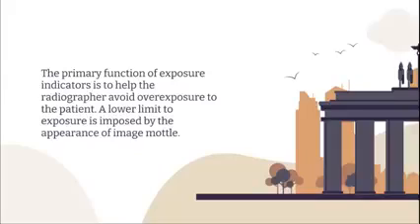Okay? To avoid either extremes, again, overexposure and appearance of image mottle due to lesser provisions of X-rays, it is useful to define a target range for the exposure indicator within which the radiographers should strive to keep all exposures. So dapat, pag mag-expose ang radiographers, the exposure indicators na nasa scale mo ito ilahang i-pursue na ma-achieve nila na ito dito lang din para makaprovide sila og gwapo na image and also keeping the principle of ALARA.